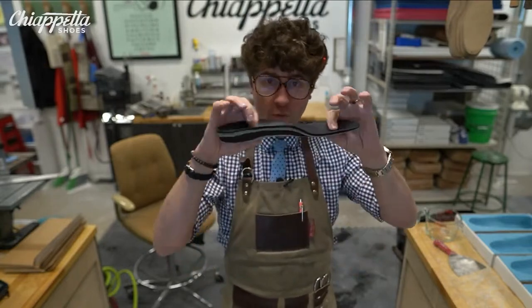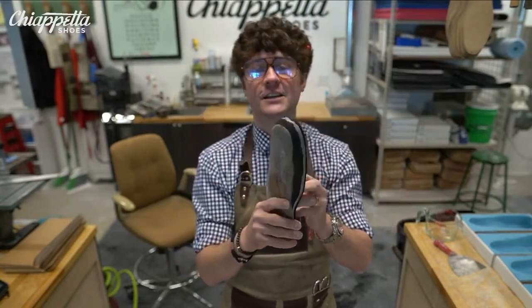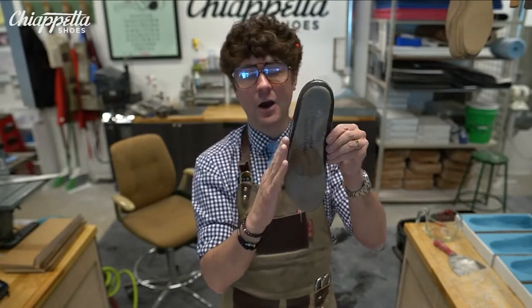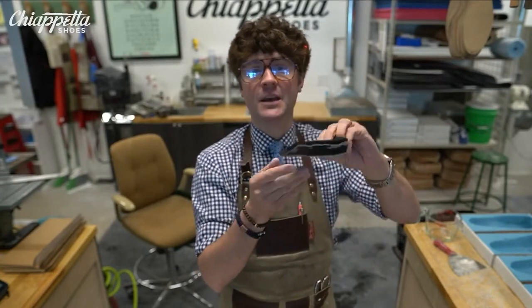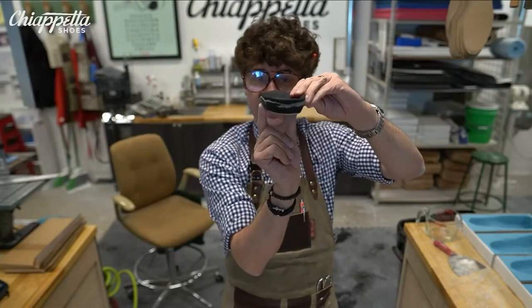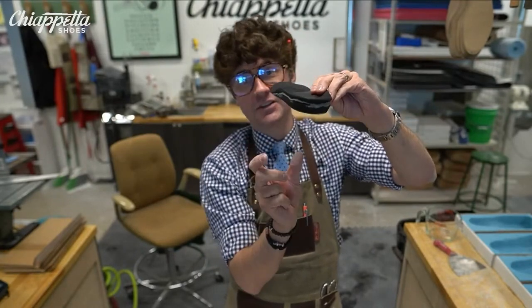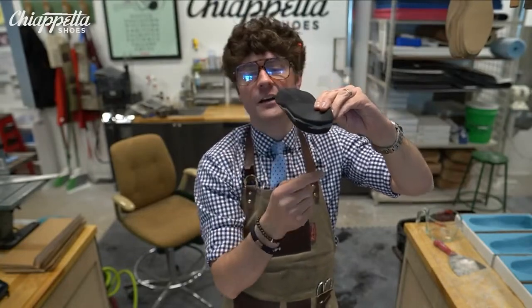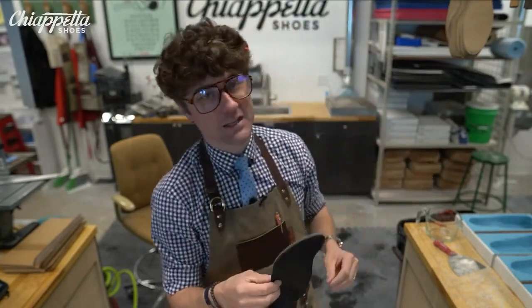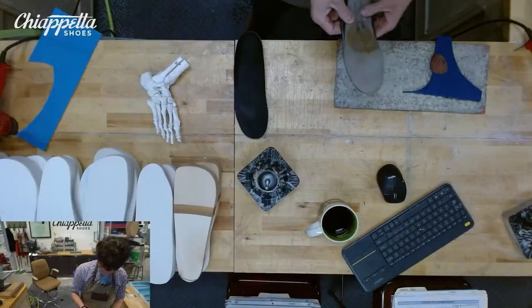So overall thickness, wall height, and then the third main variable when you're making an orthotic is the base width, how much it's taking up at the bottom. If it's too fat, it's going to curl up on the inside of the shoe. So this area down here has to sit naturally inside of the area on the bottom inside of the shoe, the strobel board area. So that's the main factor. Now, take the top down again.